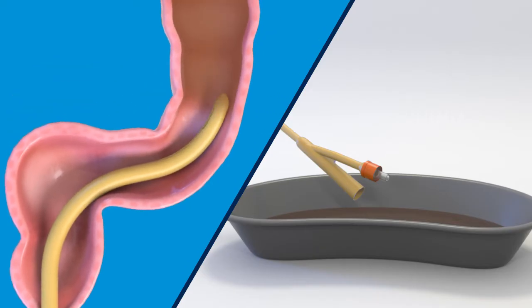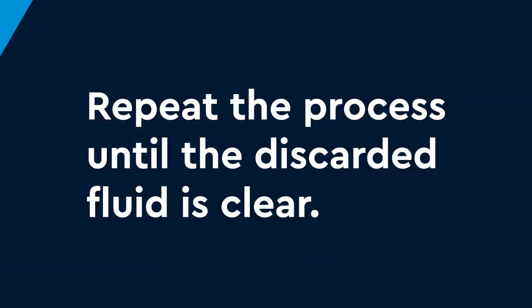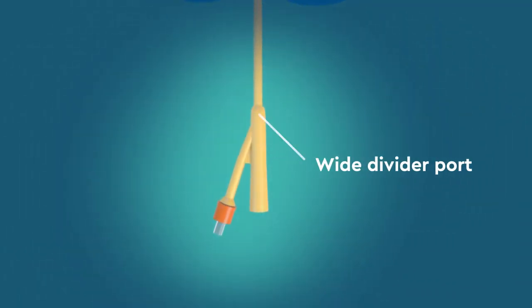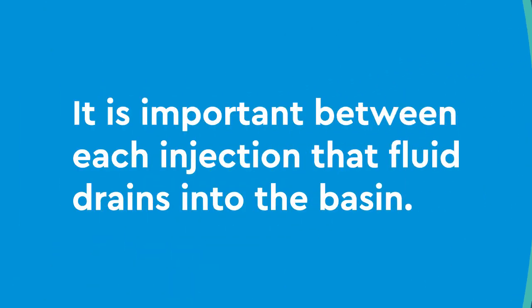Advance the catheter about one inch and repeat the process until the discarded fluid is clear. Do not advance the catheter further than the wide divider port. It is important between each injection that fluid drains into the basin.